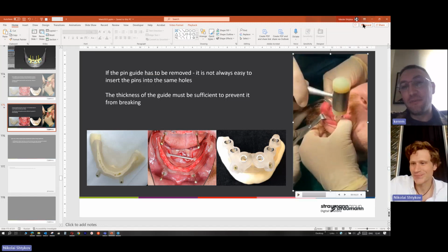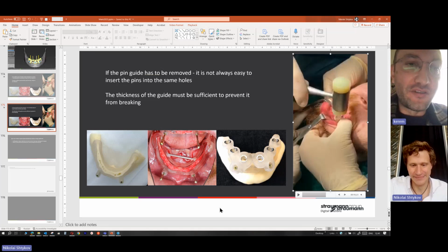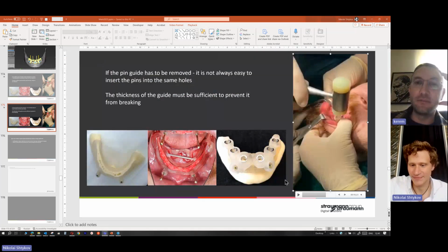You mentioned the calibration, and it's really important. We have some troubles sometimes about it. Yes, of course, this is an important thing. So can you show me the temporary from the real patient? We don't use this. That was not immediate implantation in real. In real, the surgery was stick it and leave it.